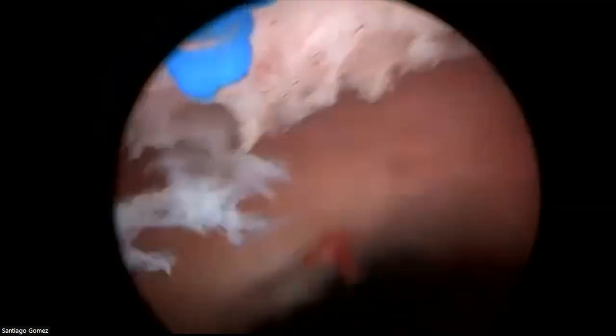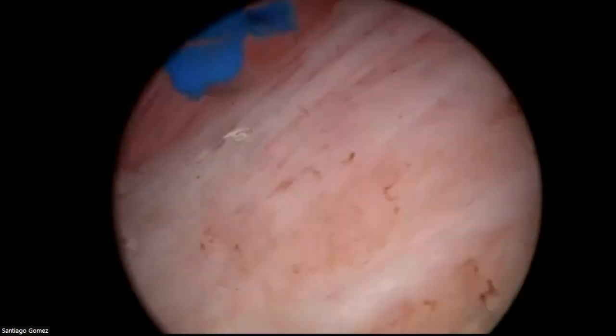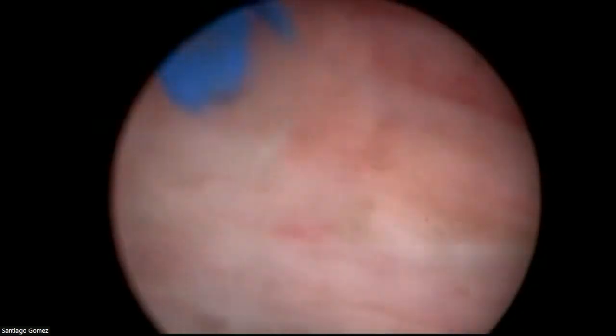So let's go anteriorly and check. See, we have a nice fossa. Nice sphincter. Let's do the ultrasound now, because before we did it at the end.